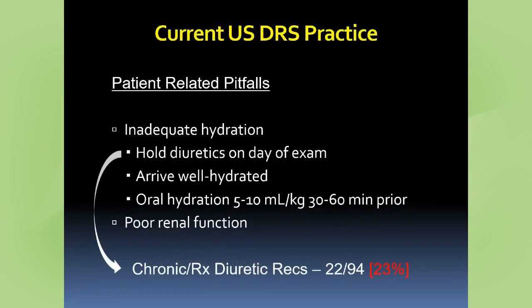So how are we doing on holding diuretics on the day of exam? I hinted at earlier, we're not doing so well. Only 1/4 of us address it in our protocols, in our reports. Again, hopefully in practice, maybe it's a little bit higher than that, but right now we're showing poor compliance. And again, if the patient takes their Lasix that morning of, it could really offset all of the work you've done telling them to get hydrated, because they've already urinated off maybe a couple of liters worth of fluid, and so they're actually arriving dehydrated to your clinic, or certainly not well hydrated.